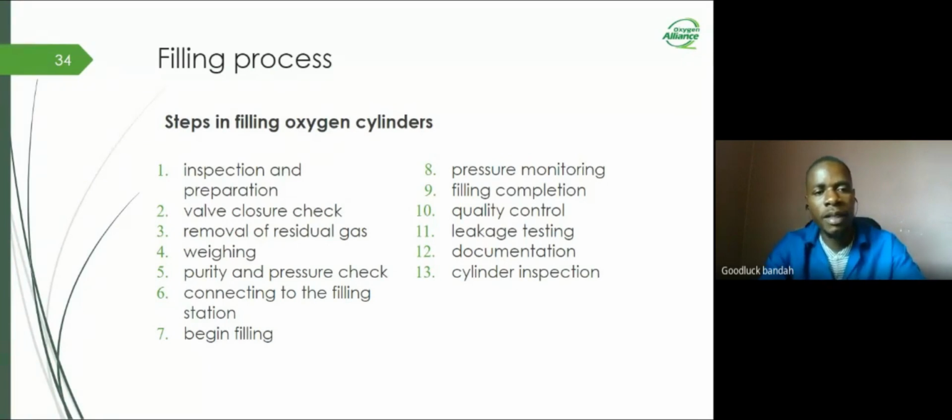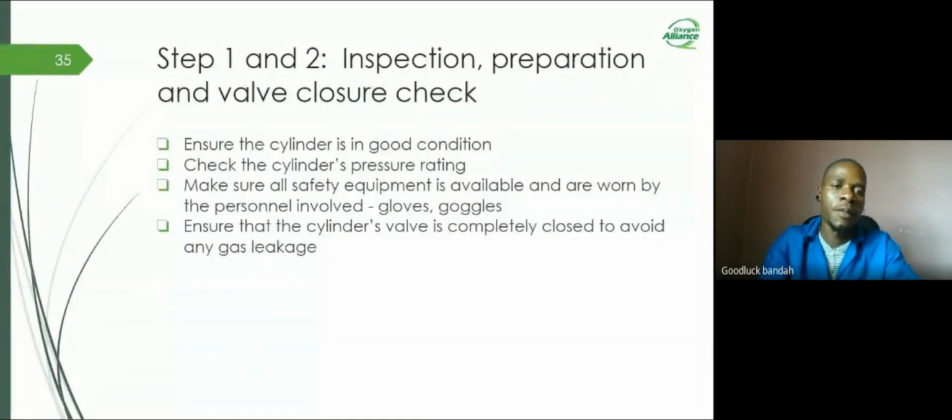And then you can connect the cylinder to the filling station. Once you start filling the cylinders, you have to continuously monitor the pressure. And after completion, you have to do quality control, leakage testing, documentation, and thereafter you can do visual inspection on the cylinder. Now let's look at these steps in detail.